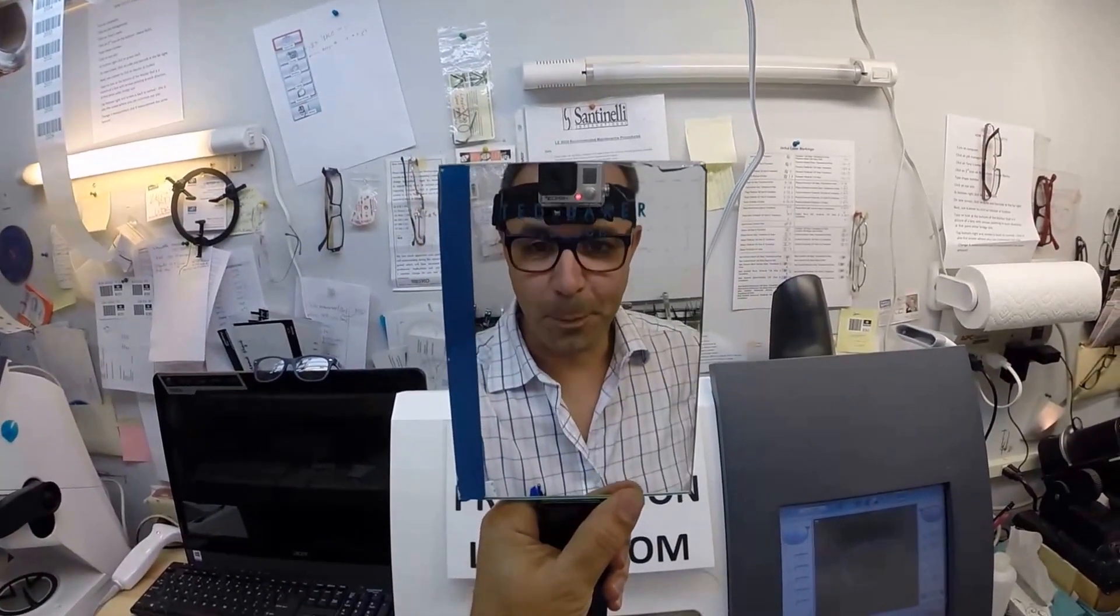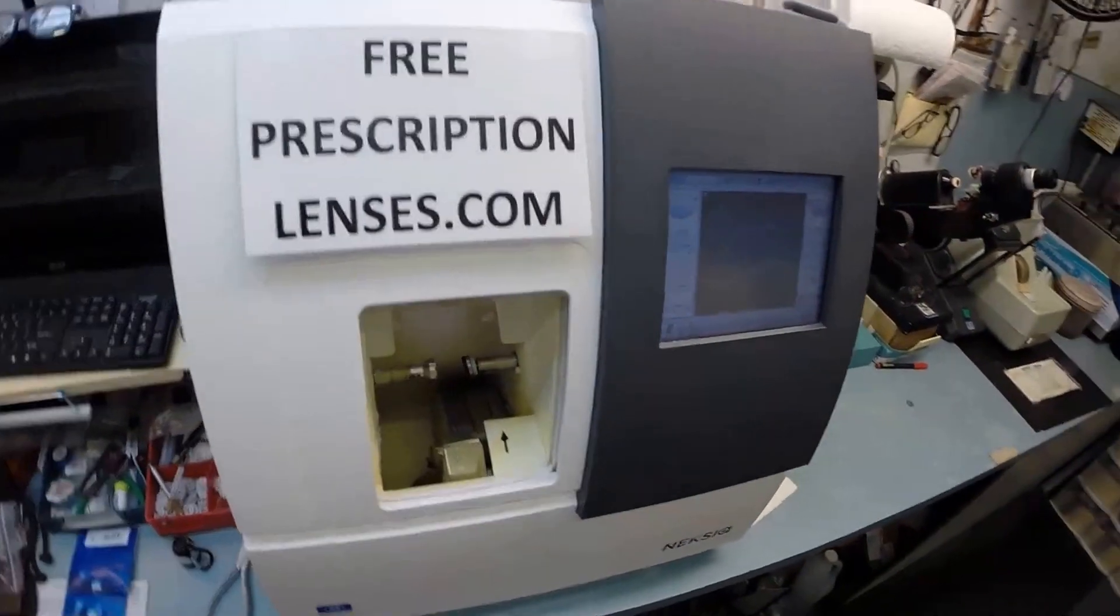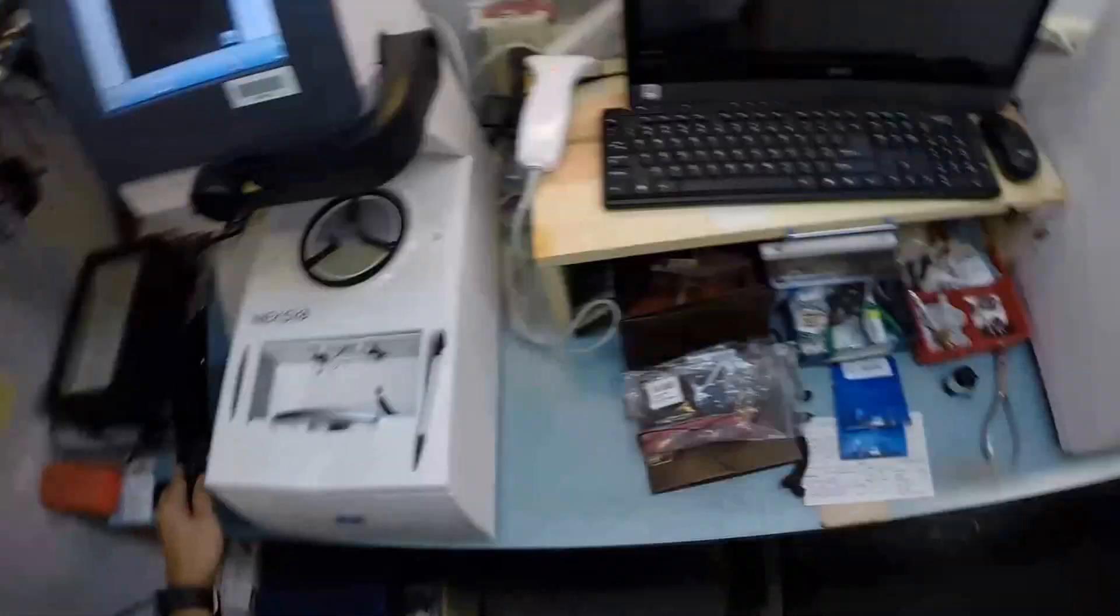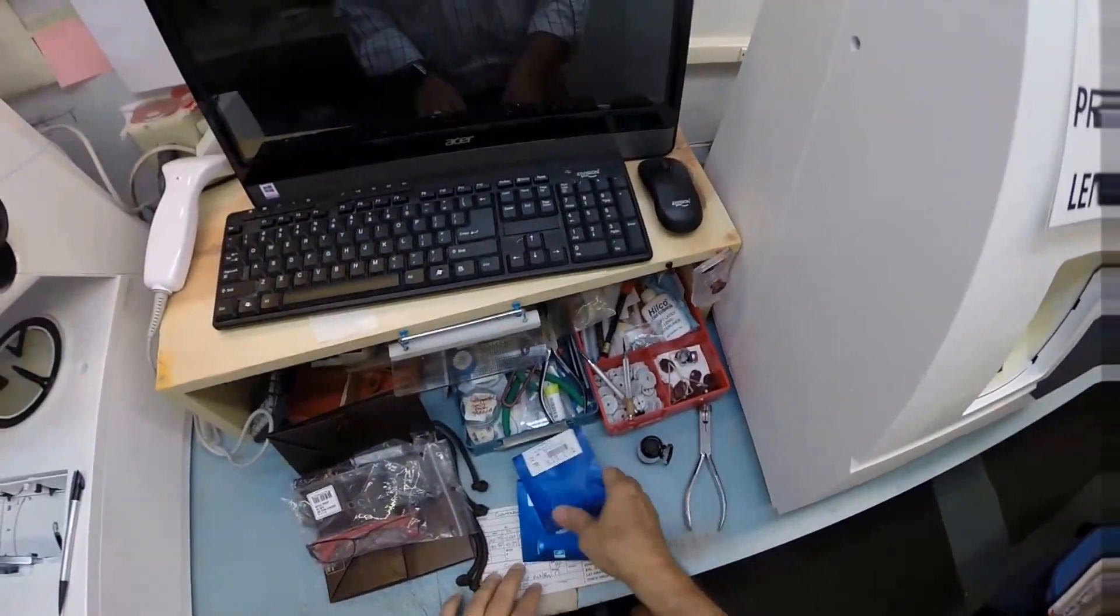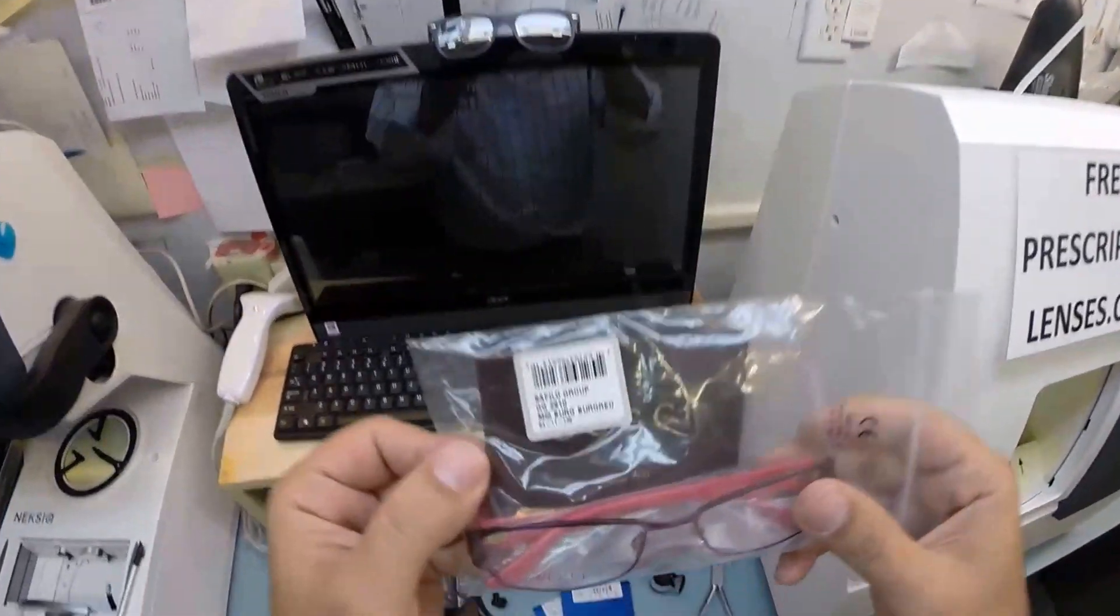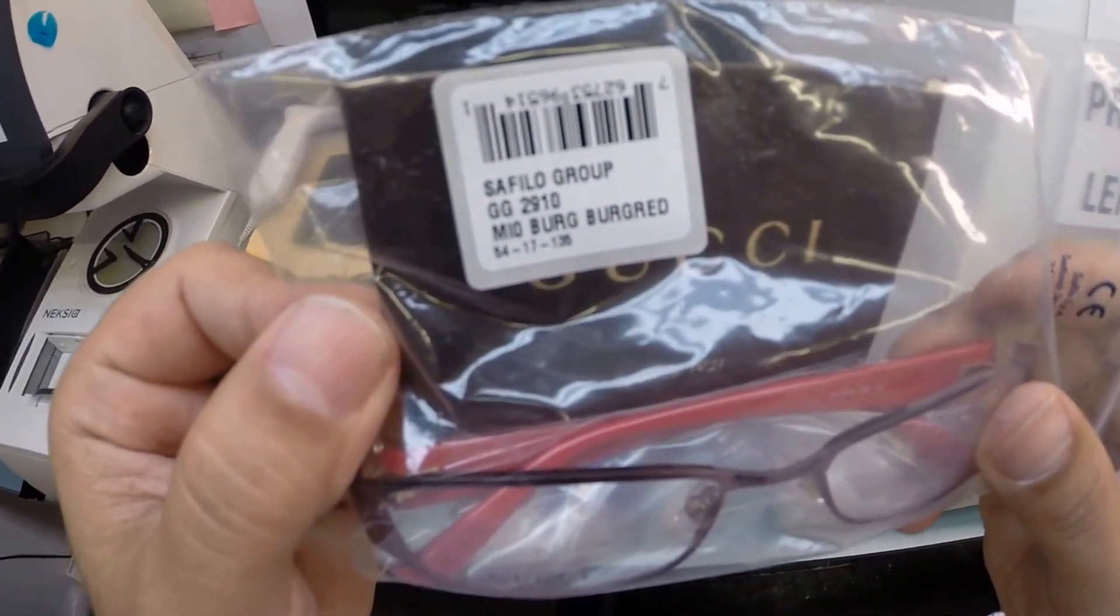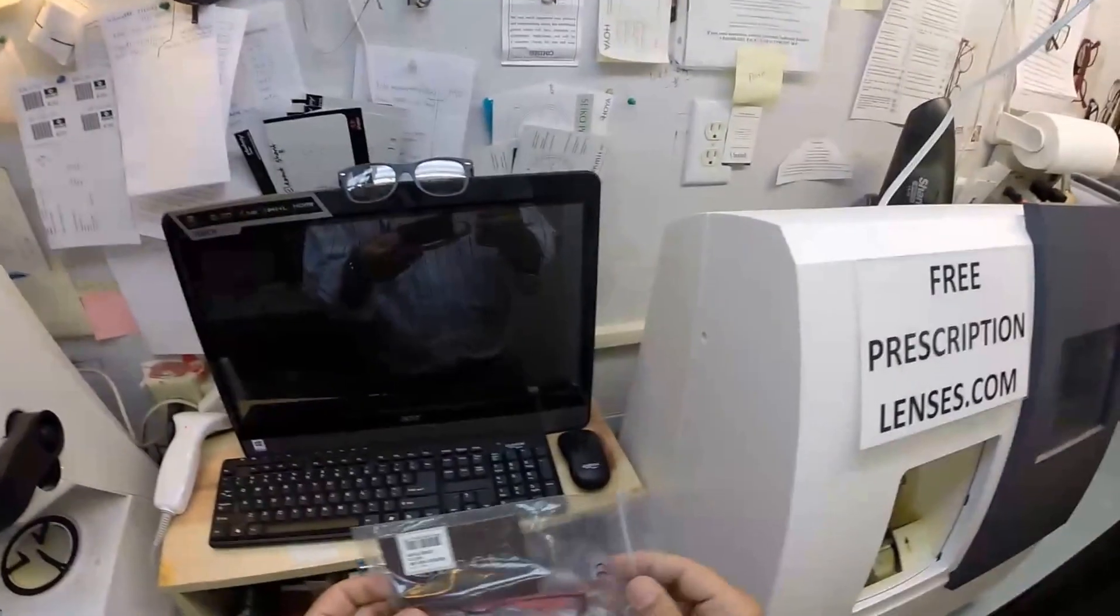Hey Courtney in Graham, North Carolina. Should I call you Court? Matthew here with FreePrescriptionLenses.com and with the help of my GoPro camera, I'm going to show you how I cut prescription Crizal Alize lenses for your Gucci 2910 color M.I.O., which is the pink burgundy in the 54 eye size.